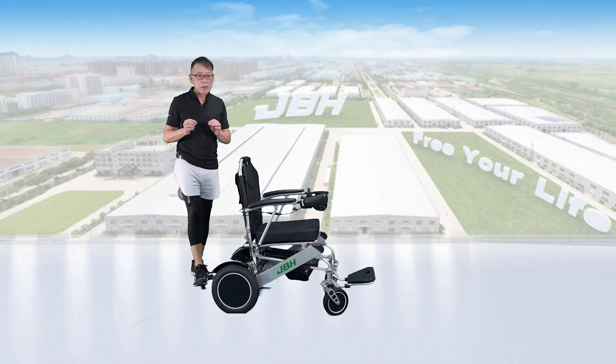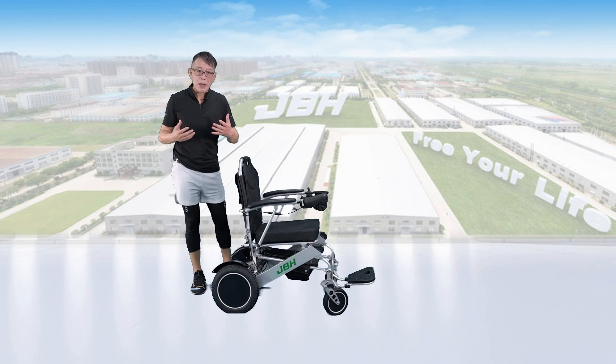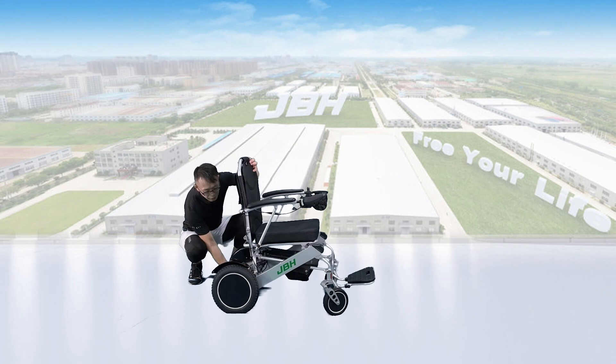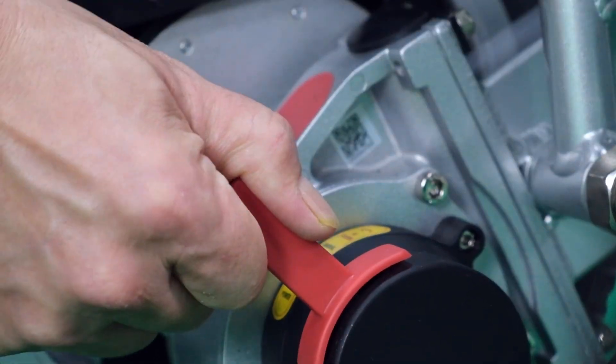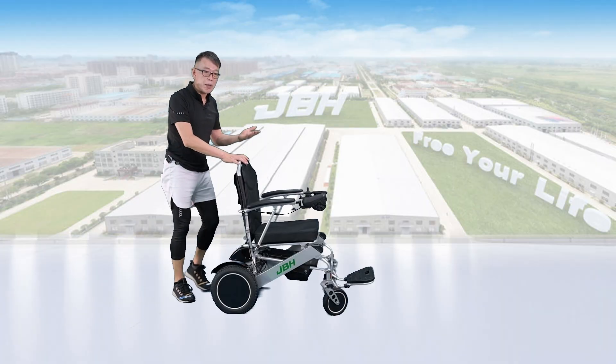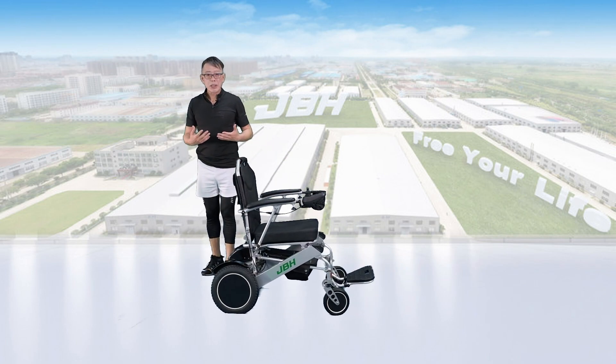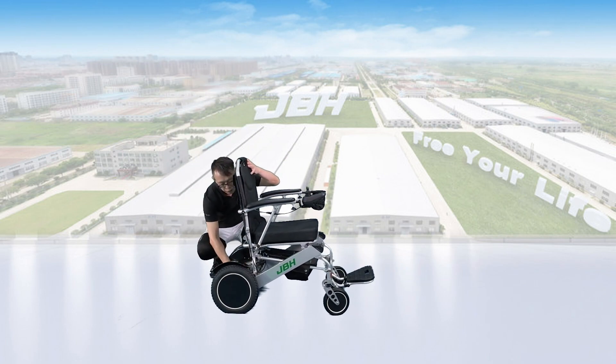The wheelchair has a three-wheel mode design that allows you to switch between manual and electric control. If you want to switch to manual, just push the lever up, and then you can push it by hand. Or if you want to choose electric mode, just push both levers down.